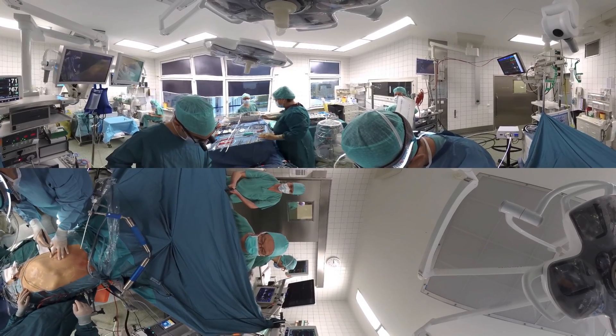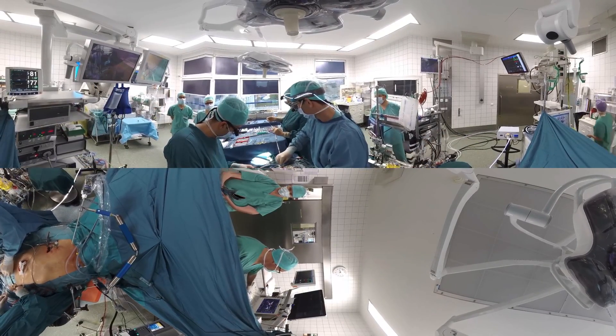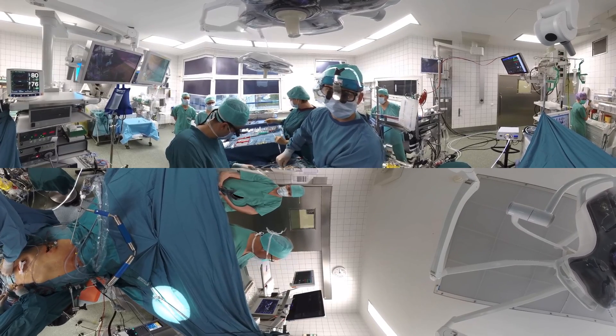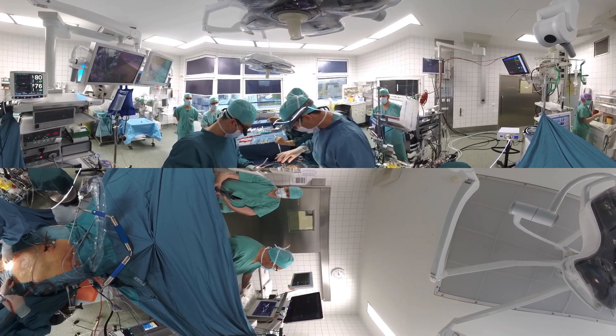The patient is a 65-year-old male who presents with mild shortness of breath due to severe mitral regurgitation, that is a leaky heart valve. The plan is to perform a minimally invasive mitral valve repair operation, so-called keyhole surgery.